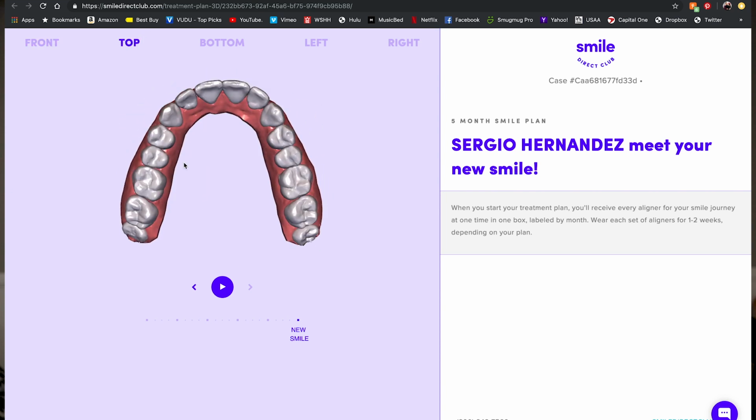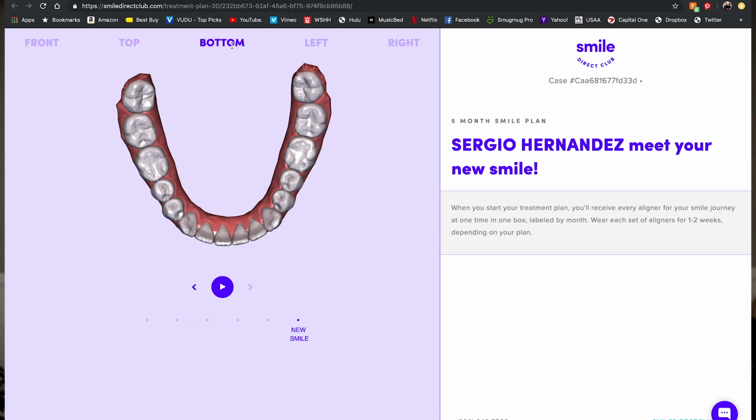If I show you guys from the top and I push play one more time, those are my original ones, then 2, 3, 4, and 5. And you'll see right there that all my teeth are pretty much straight, and that's what they are here to do, to straighten out your teeth. That's the business model. The bottom ones, again, these are the ones that I didn't really care for.